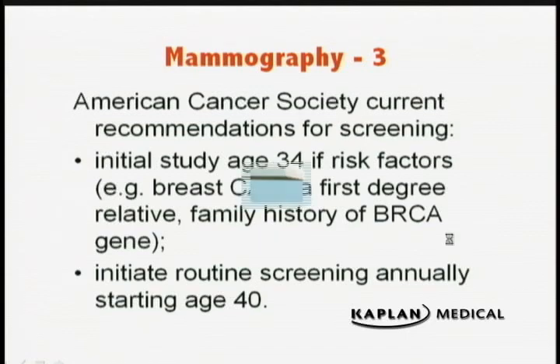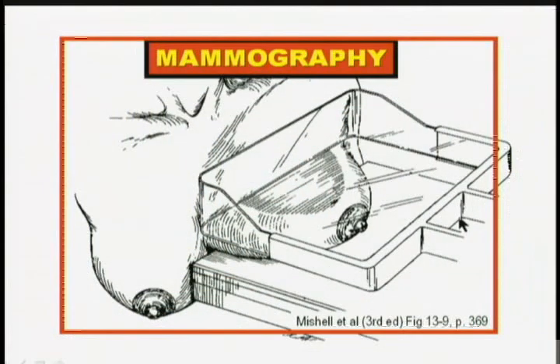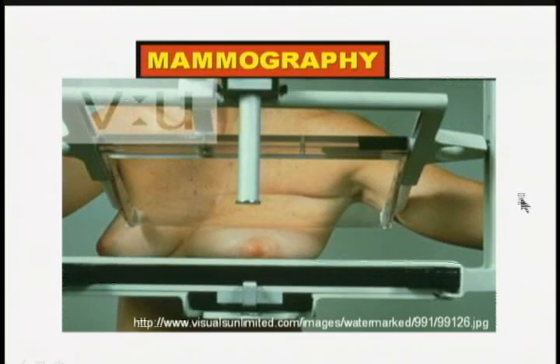Here you can see a woman who is having a mammogram done. She places her breast on this instrument, which then compresses it. The purpose of the compression is to get the tissue as thin as possible so you get maximal penetration by your beam. I went when my wife had her last mammogram, and I put my arm in to see how much compression there is, and it is a significant compression.